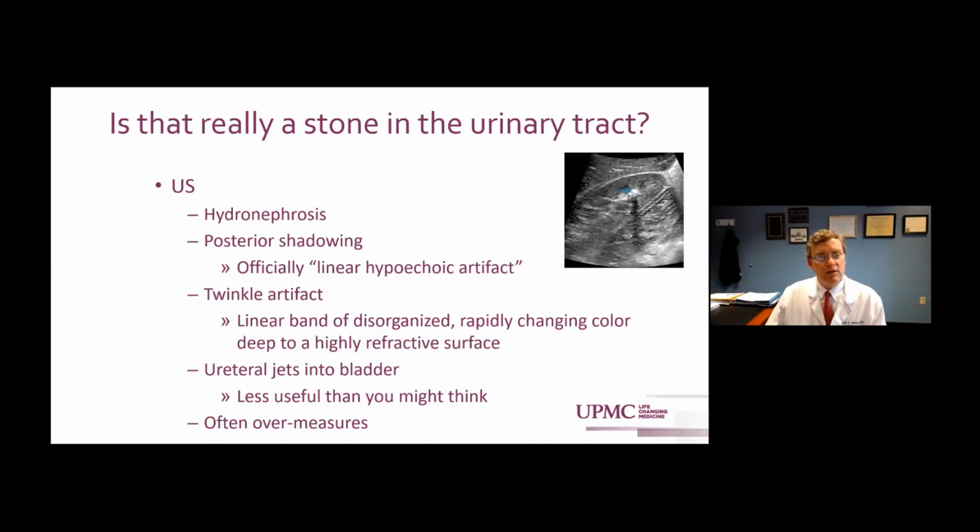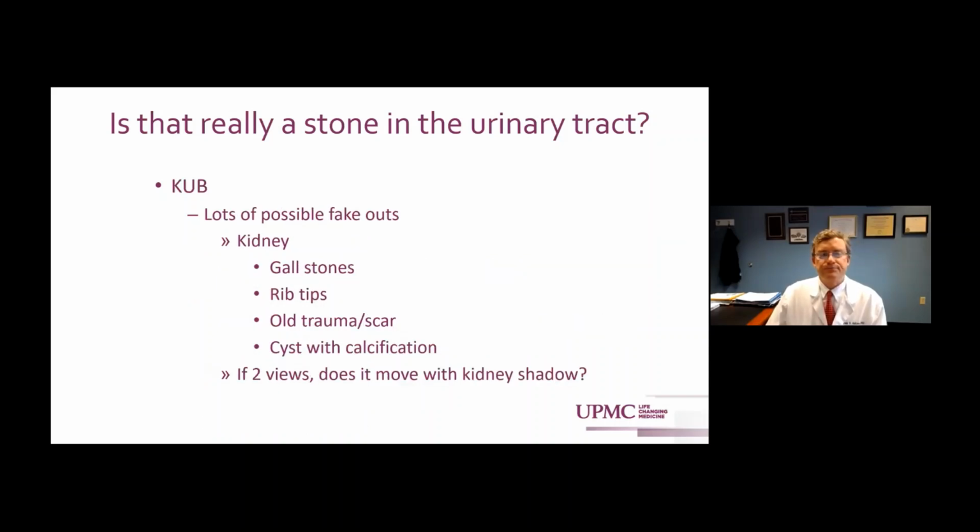Ureteral jets, certainly not as useful as I'd like it to be, but if you do see good, strong, frequent jets equally on both sides, that's a good thing. If you see nothing on the one side, that's a bad thing, and in between, it's hard to tell. I find that ultrasound often over measures, or at least our radiologists often measure stones as larger than you would think, and sometimes that leads you to conclusions you don't want.